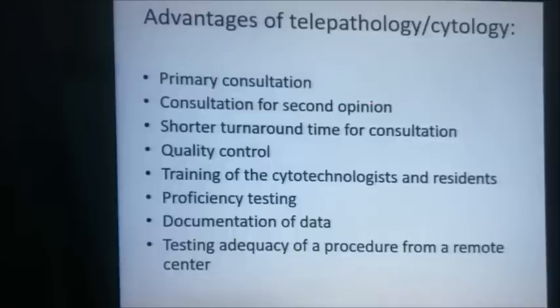Also, you can be asked for a second opinion, okay? This will make it easy to have access to a digital slide. You can see the whole image. Instead of someone sending you photos, you can have the whole slide or multiple slides, and you can have access to them. You can magnify, zoom in and zoom out. There will be a shorter turnaround time for consultation. Instead of sending the slides by post and waiting for them to arrive, this can happen in seconds. Quality control, yes. For quality control, you can say that this section is okay, is good, is scanned very well, etc.